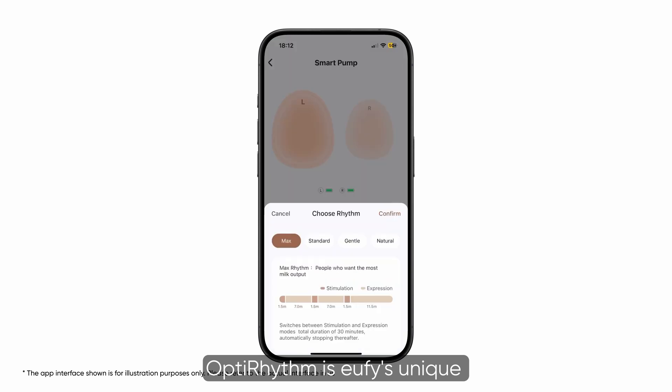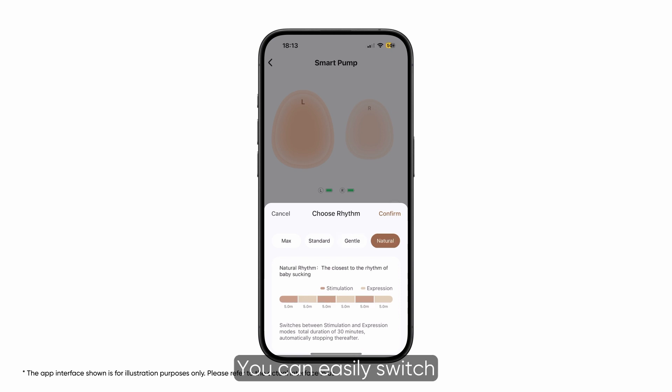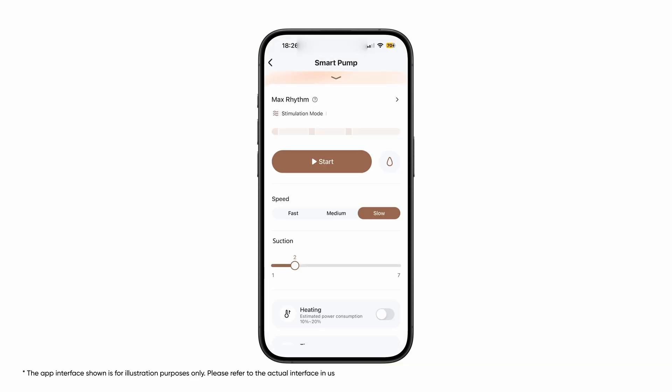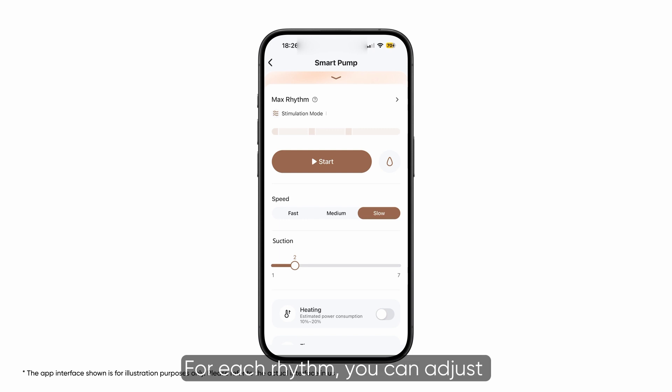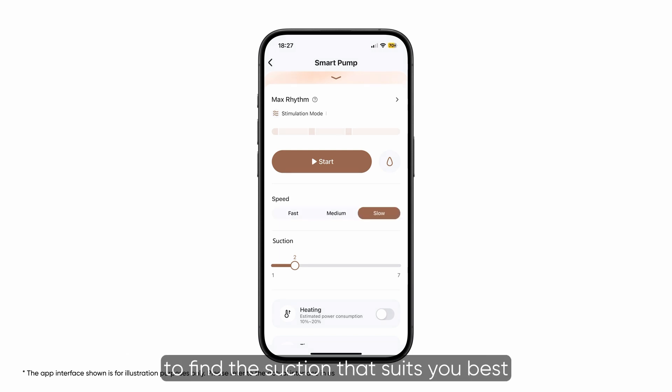OptiRhythm is Eufy's unique smart pumping technology designed to meet the diverse needs of moms. You can easily switch between four different rhythms. For each rhythm, you can adjust from seven intensities and three pump speeds to find the suction that suits you best.